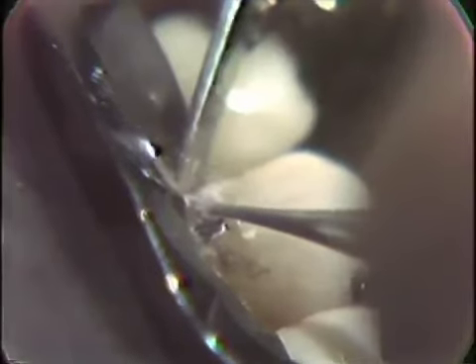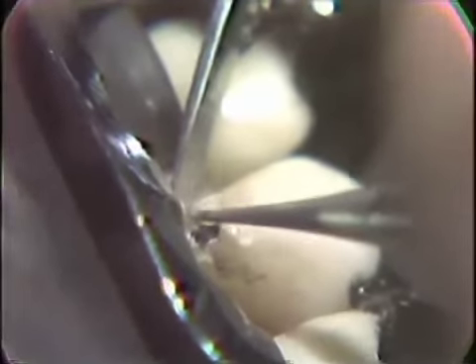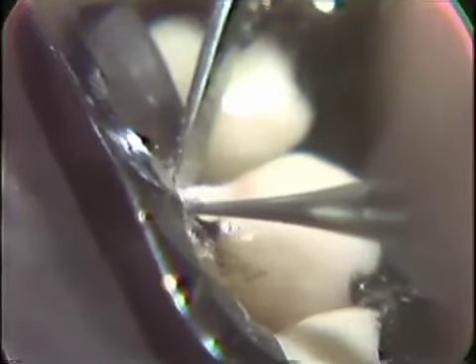So we'll enter into the carious lesion, and with the base of that burr, extend on over to include our reference point, letting this preparation, of course, be based into dentin, based into dentin sufficiently so that we can establish retention in this area. All right, the mesial wall now is prepared.